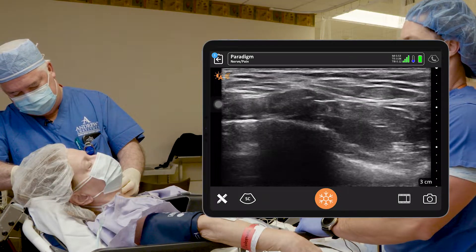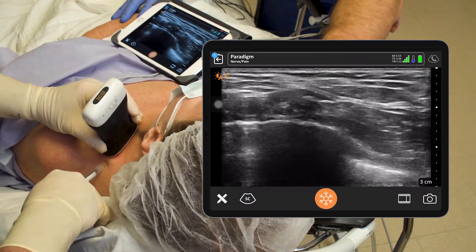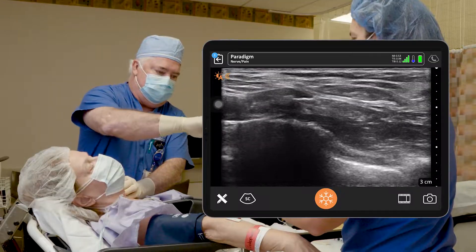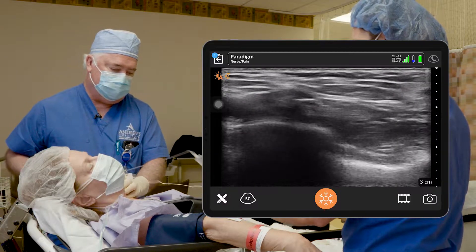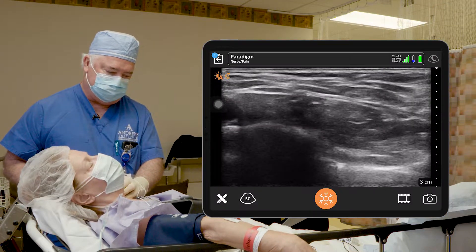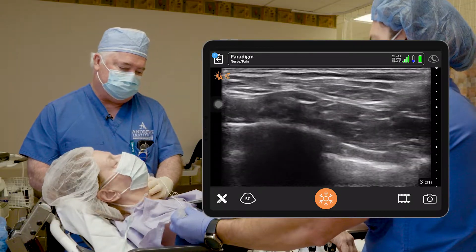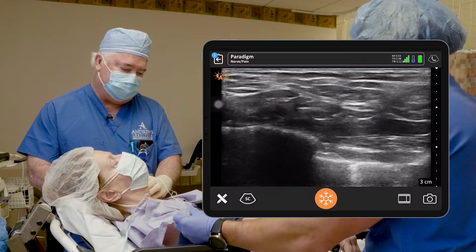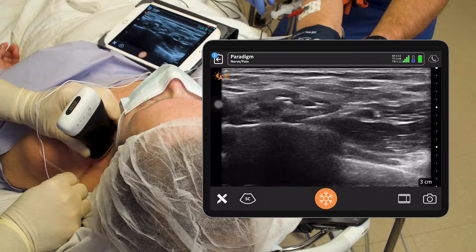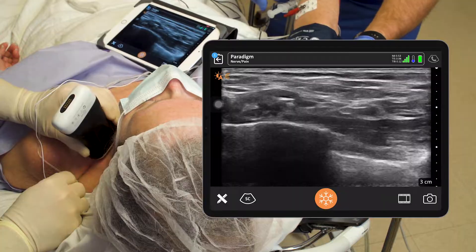We're going to put a little number shot in here. We're going to use a stimulating needle, so if we get too close to nerves we'll get a twitch. Coming in posteriorly here — getting a little twitch there, so we'll back up. Here we come — you can see the needle, you can see the rib. We know it's safe here, we can advance. Hitting the rib actually, so I'm going to come back and try to get a little further over, close to the artery.